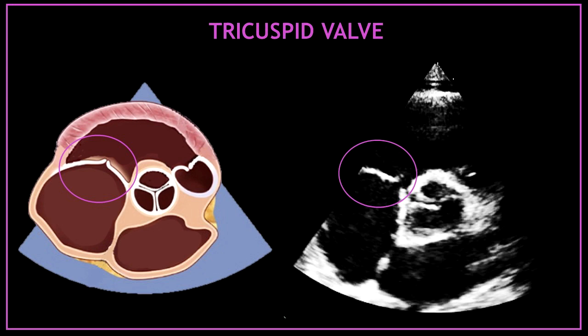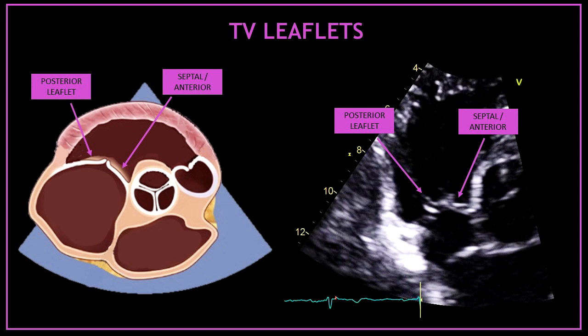On the left hand side, dividing two chambers, the first valve we can visualize is the tricuspid valve. In this view, and depending on the cut, we can differentiate the tricuspid valve leaflets. The leaflet located on your left hand side is always going to be the posterior leaflet. However, on your right hand side that leaflet would be the septal leaflet or the anterior leaflet depending on the cut.